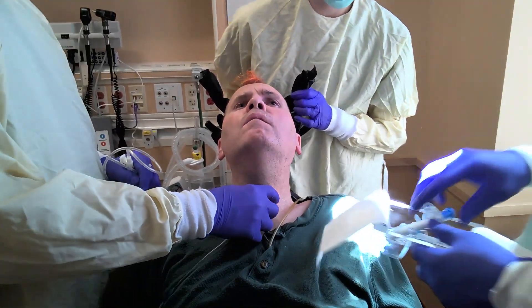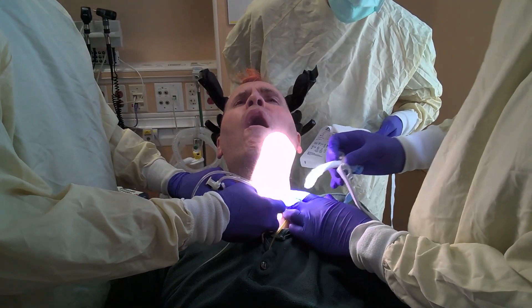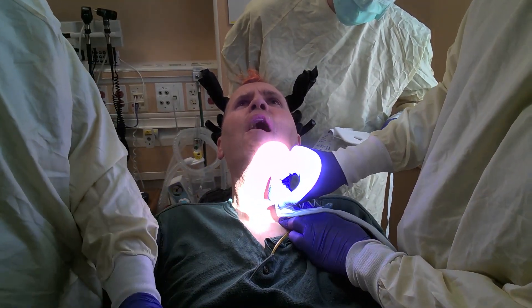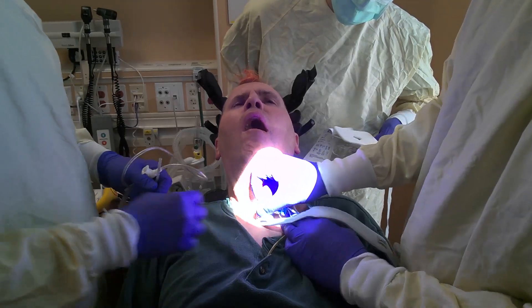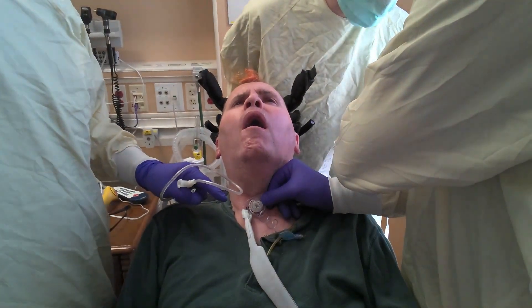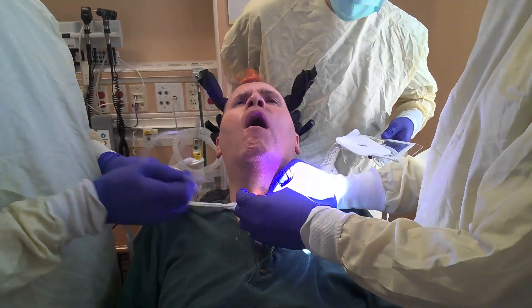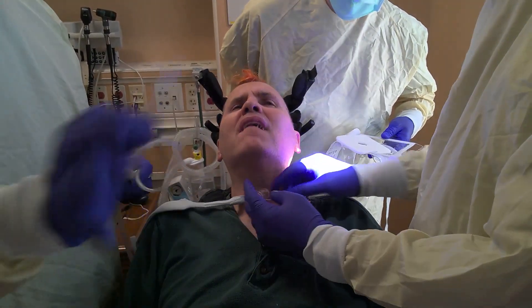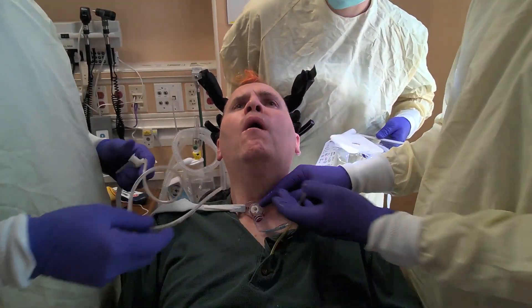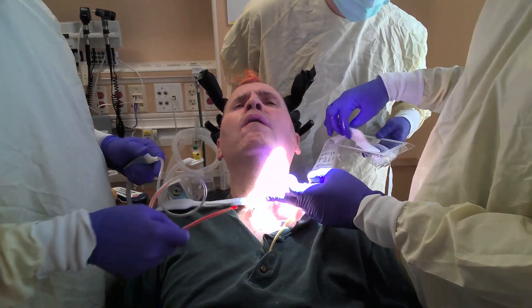Ready? Almost done. One, two, three. A little pressure here. You guys want to keep that? Okay, there we go. Alright. Okay, good to know. We can do this in the chair.